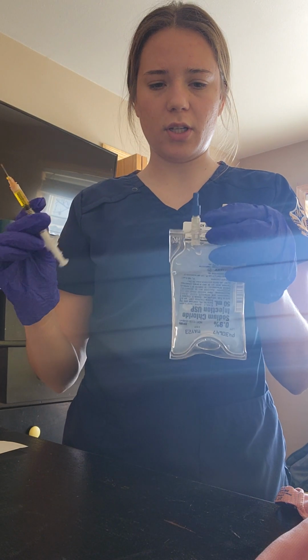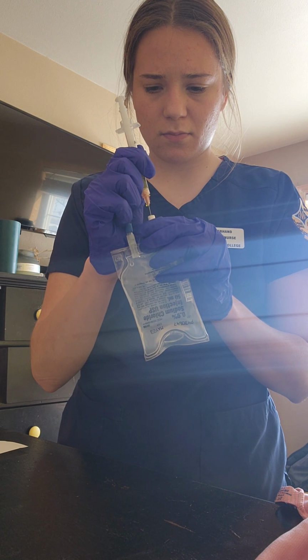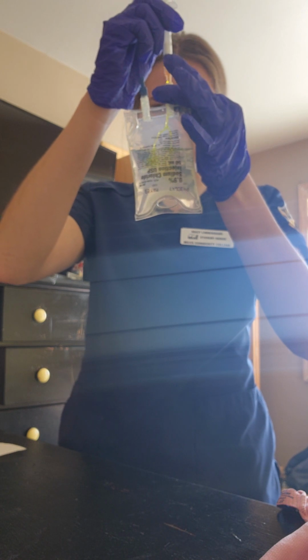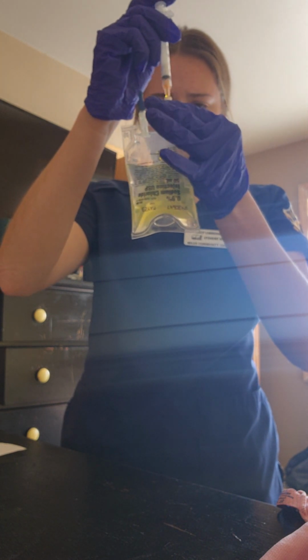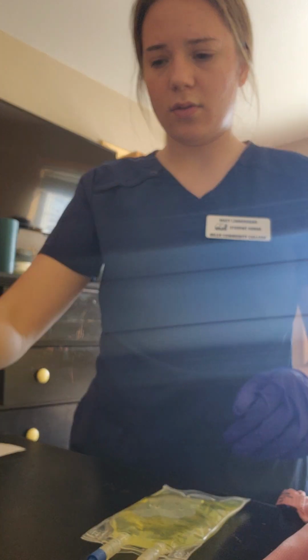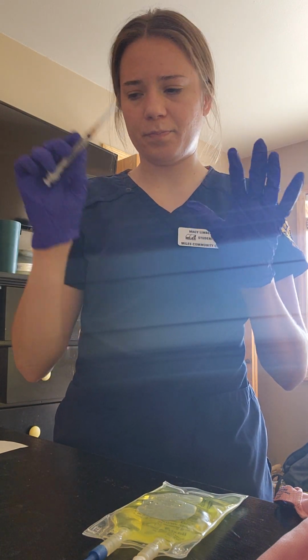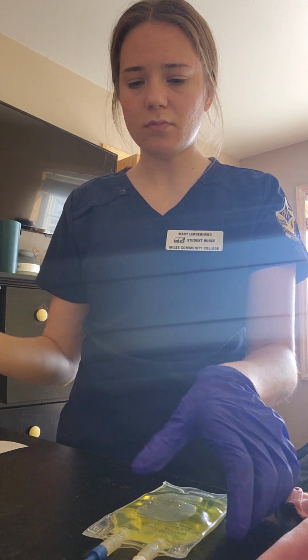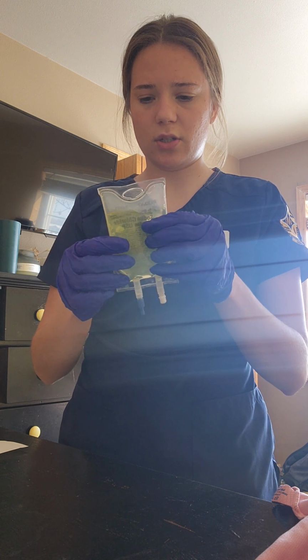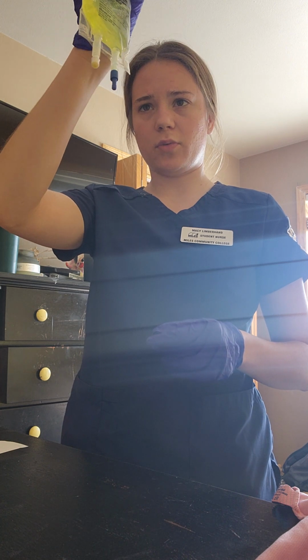Now I'm going to put it into this IV bag. Okay. And I will throw this into the sharps container, and then I'm just going to mix this around, just making sure it's all mixed up and that everything looks normal with it.